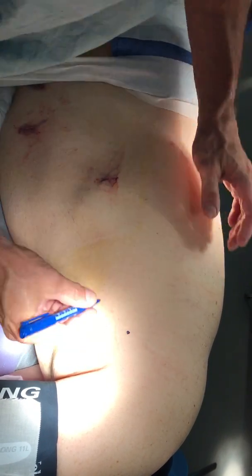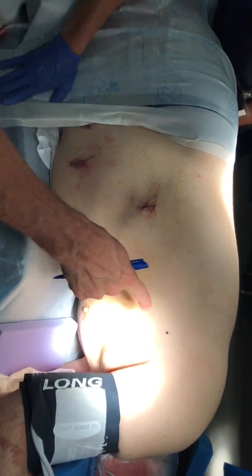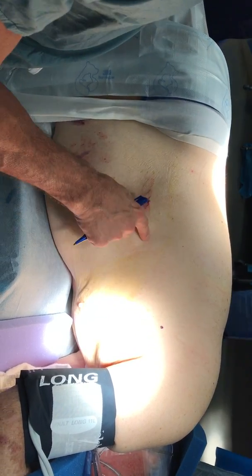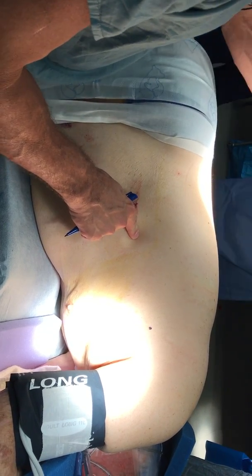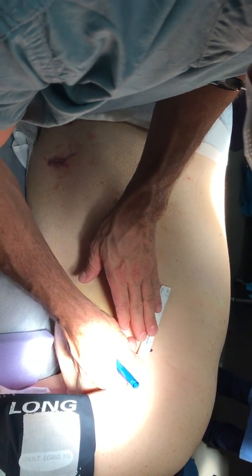I have a ruler, please. So that's where that port's going to go. Then you're going to go nine centimeters, and it's not in a straight line. You go in a straight line down, you get the diaphragm.